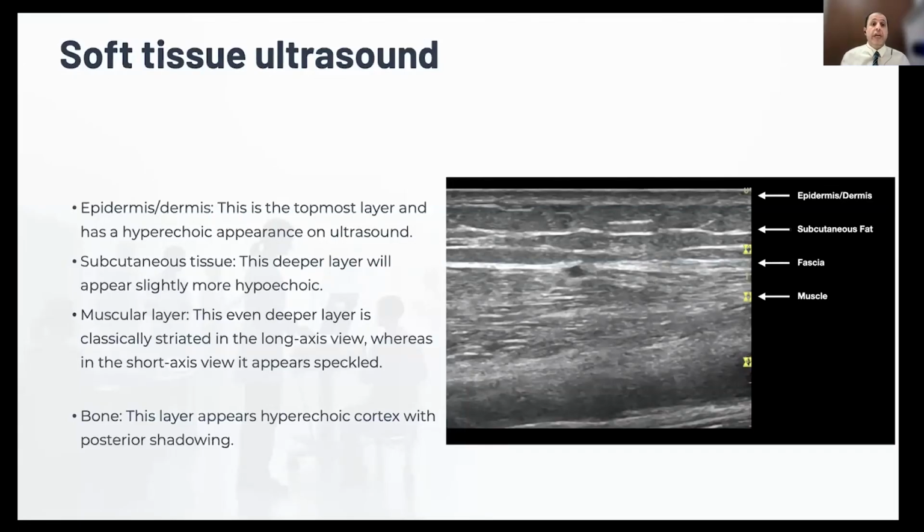So before discussing abnormal findings in soft tissue infection on ultrasound, let's discuss the normal ones. If you understand the normal ones, we can also detect abnormalities and pathologies more easily. When you are doing point of care ultrasound, we have different layers. Maybe it's a little confusing at first, but I think it is easy to learn.